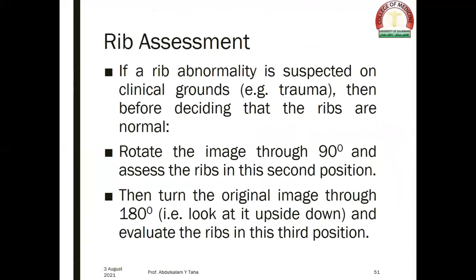Rib assessment: if a rib abnormality is suspected on clinical grounds — for example following trauma — then before deciding the ribs are normal, we have to rotate the image through 90 degrees and assess the ribs in this position, then turn the original image through 180 degrees — that is, look at it upside down — and evaluate the ribs in the new position before commenting that there is no rib fracture.